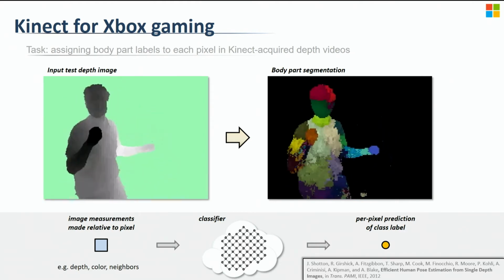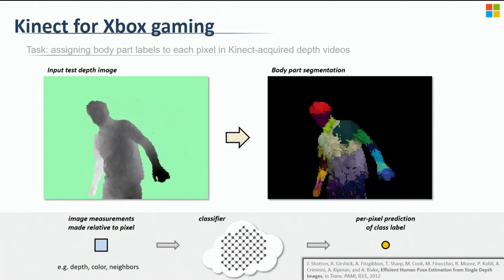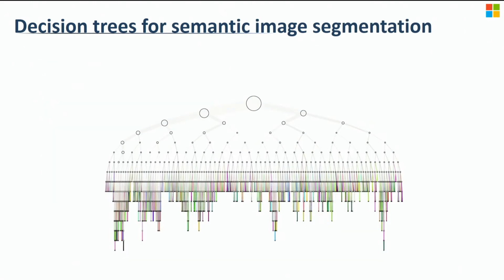Same people who worked on this, including my boss Antonio Criminisi, who is a principal researcher on this project, contributed to Kinect. So they took this idea further. This idea is based on the concept of decision trees. The algorithm has been improved significantly and has been tuned to fit this particular problem of medical image segmentation, but the core is the same.